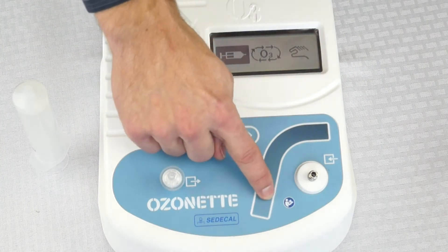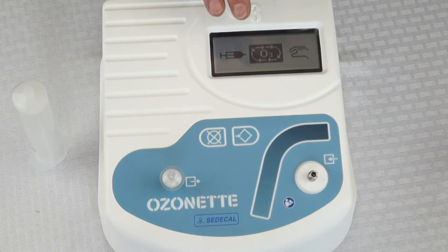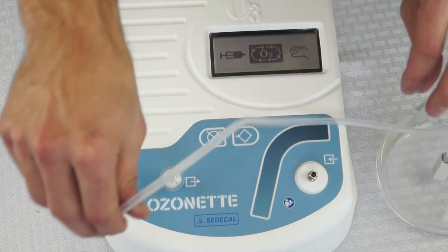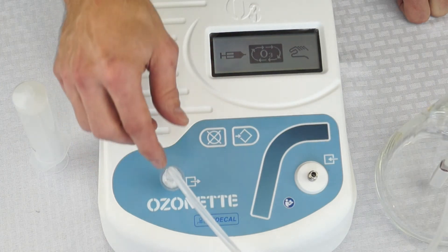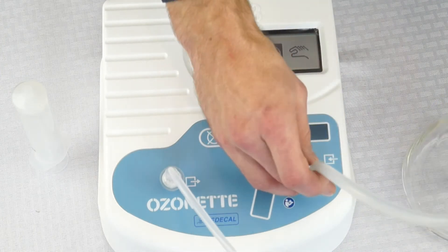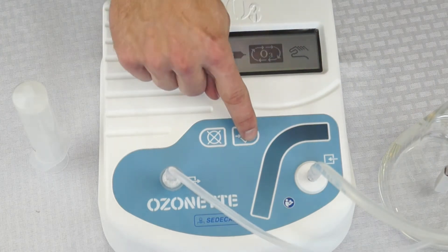Moving over to continuous flow mode — this mode is used when ozonating fluid, doing limb bagging, or something of that nature. Connect the fluid bubbler to the ozone port, also connect the destruct to the destruct port, then hit enter.